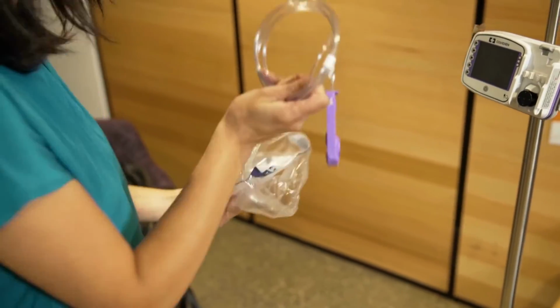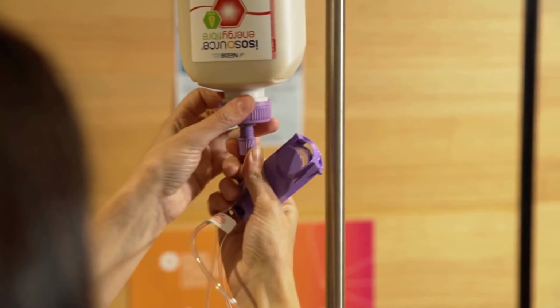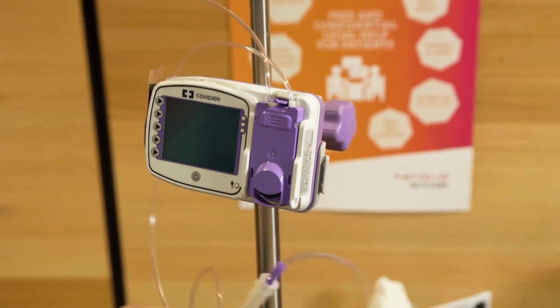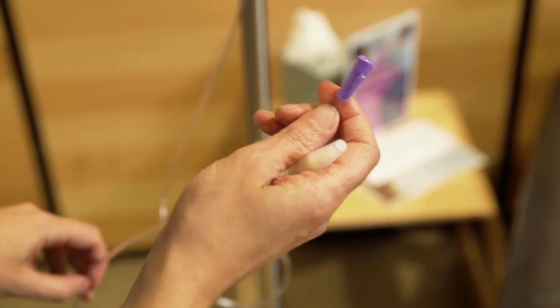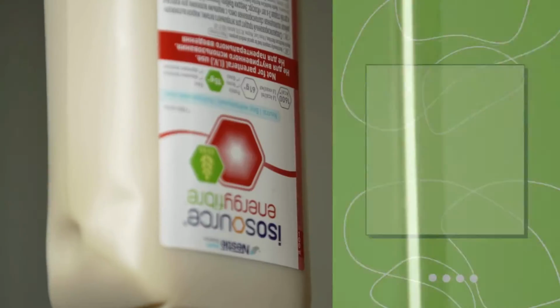Once you have that set up, you need to get your formula organised and ready to go. With your formula hanging on your pole, you'll have a spike set that will attach from the formula to the machine, your pump machine. And then the other end of that spike set will attach to the Jej tube on your abdomen.